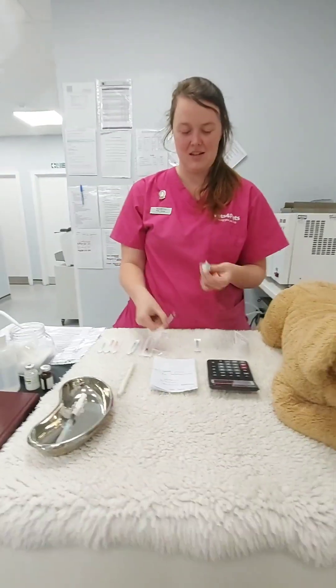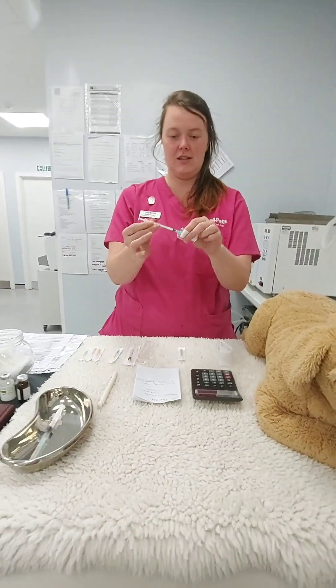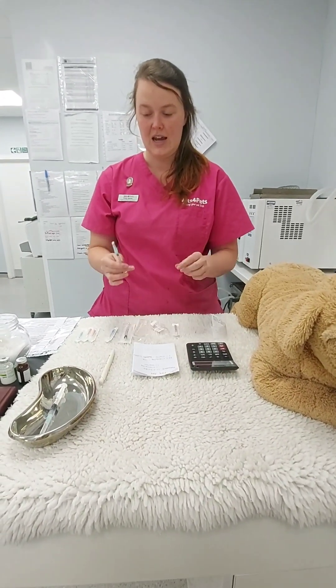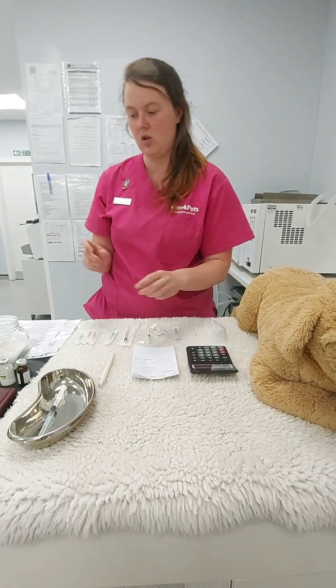There we go — real life situations. Opening up as such, inserting as such, and removing air, keeping that end as clean as possible. Now, your bottles.